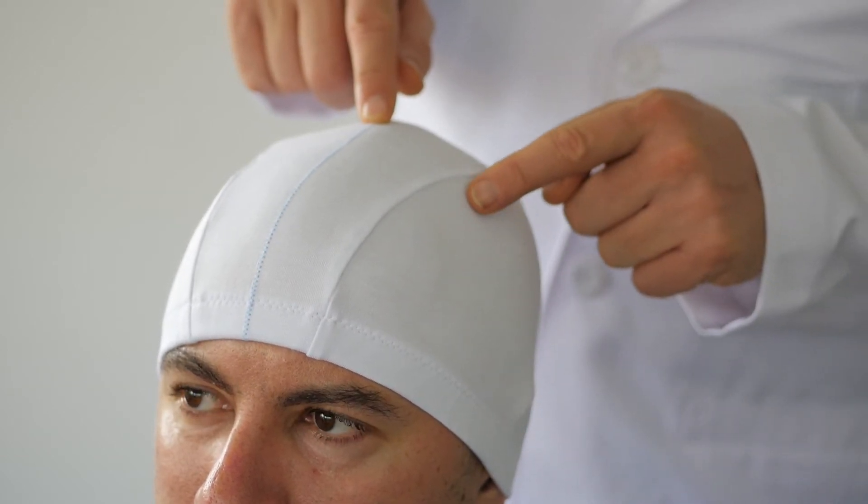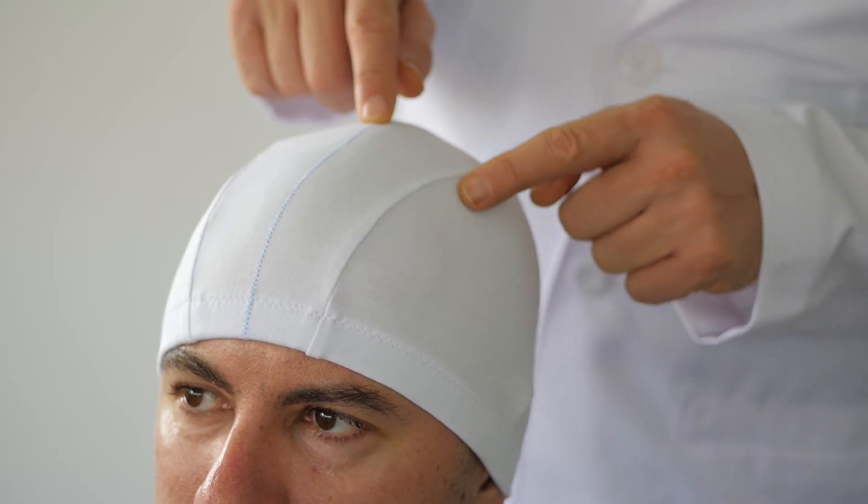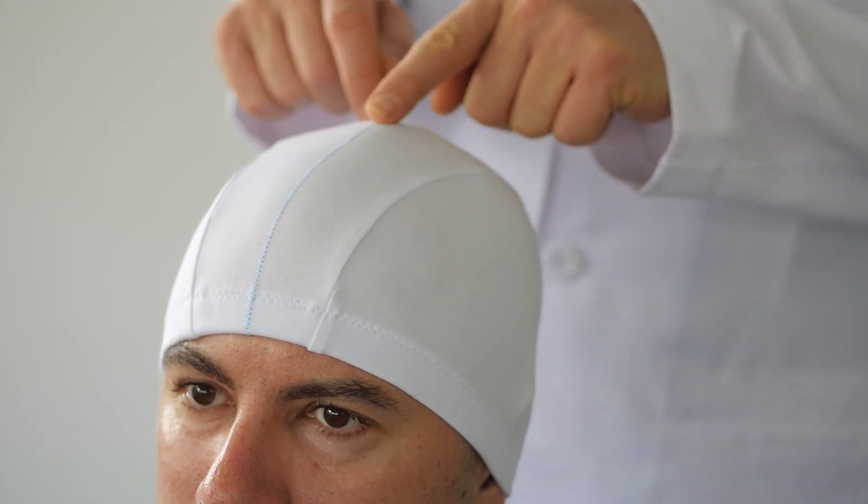When stimulating the hand area, one stimulates here, while the leg area is up here.